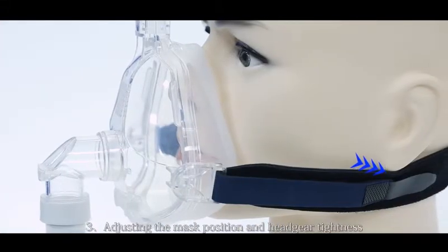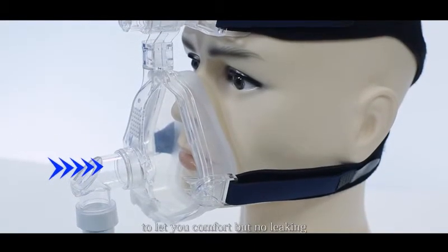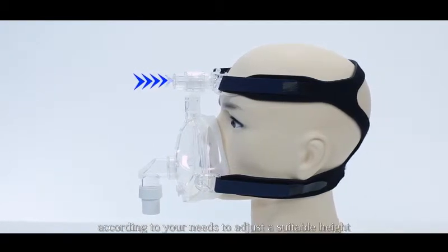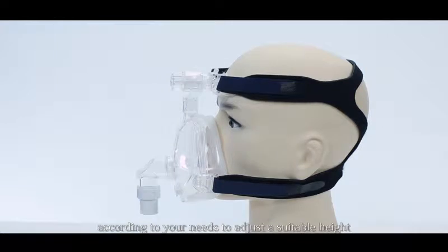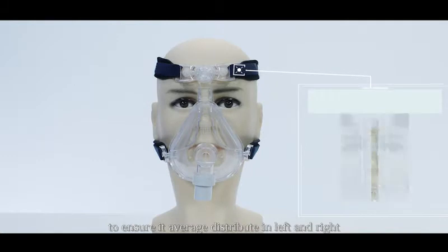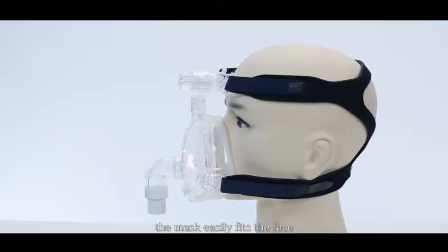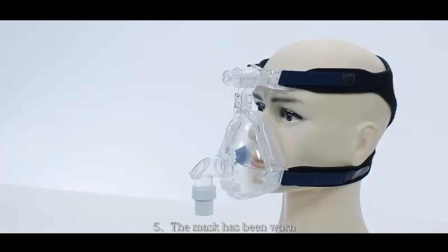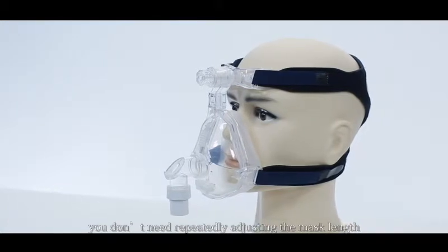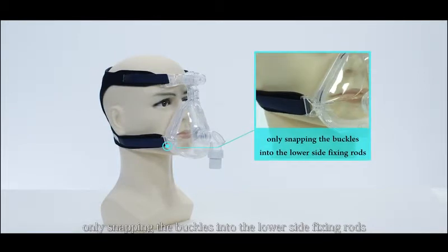Adjust the mask position and headgear tightness to be comfortable but with no leaking. Rotate the forehead fine tuner according to your needs to adjust the suitable height. Adjust the headgear position to ensure it is evenly distributed left and right, with the upper and lower headgear parallel, so the mask fits the face easily. Once the mask has been worn and fitted, you don't need to repeatedly adjust the mask length and headgear tightness next time — only snap the buckles into the lower side fixing rods.